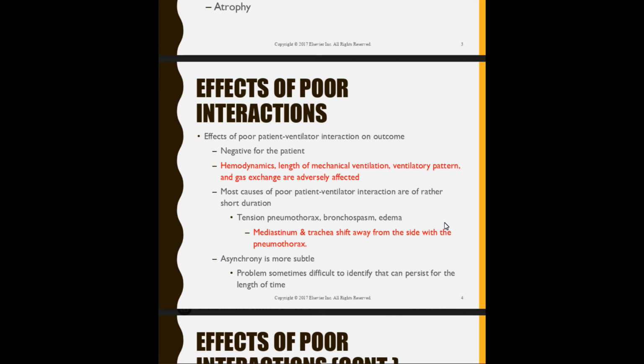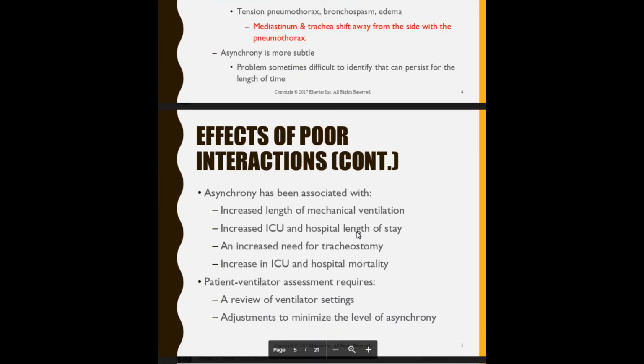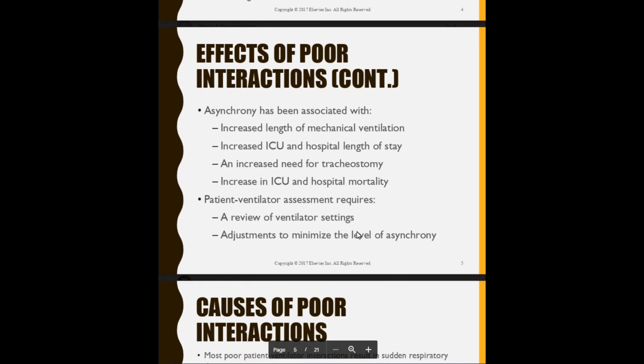And on that note, too, it's short-lived, and you can just dismiss it. You might think patient was probably moved by the nurses, patient was coughing a bit and stopped, anything, and you're thinking, okay, nothing's wrong, when in actuality they're causing an asynchronous or dyssynchronous event.